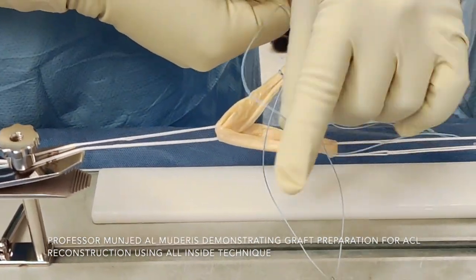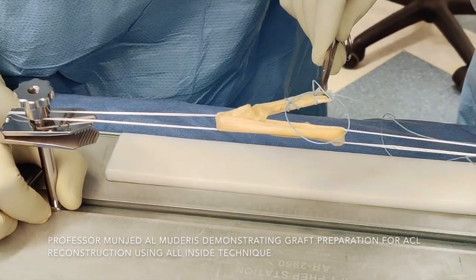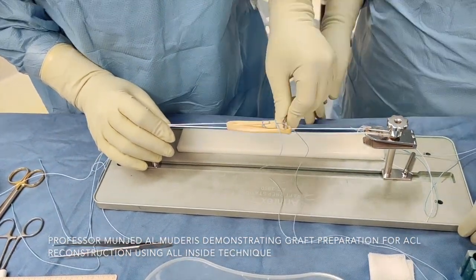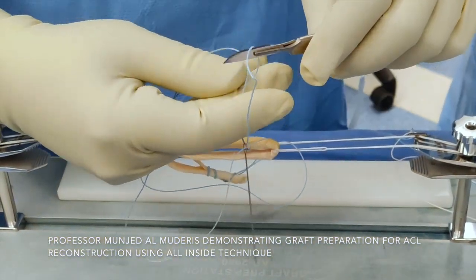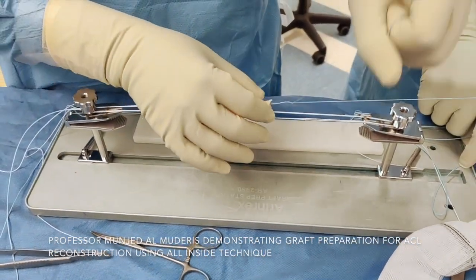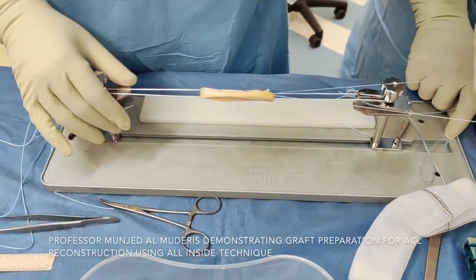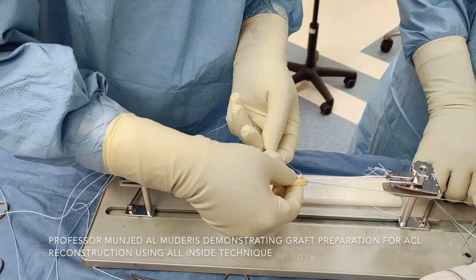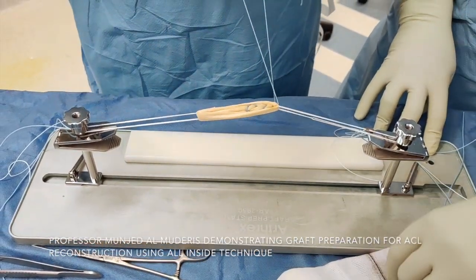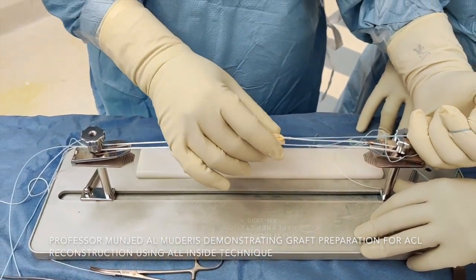This is the third pass. I then tension the station to the desirable length, making sure that all parts are tensioned equally. I then divide the fibers of the suture in half. This is the desirable tension. I exit through the external part from one end in the middle and put tension on that, then exit from the other side with the other arm. I tie these two limbs together, and this forms the apex of the graft.